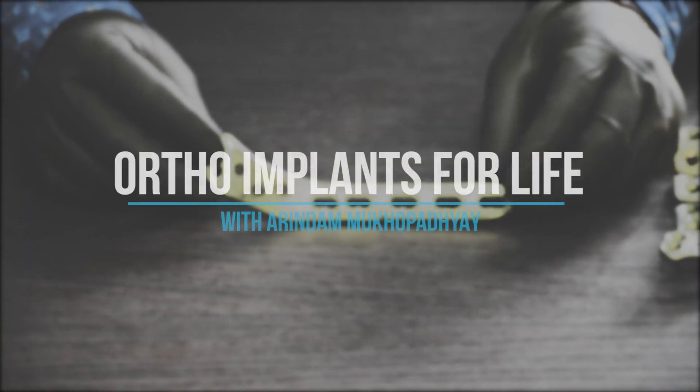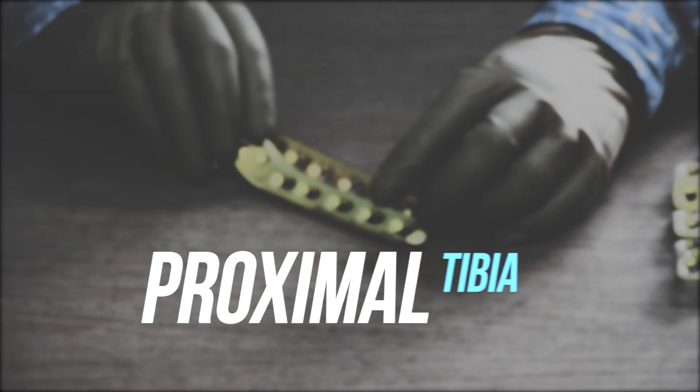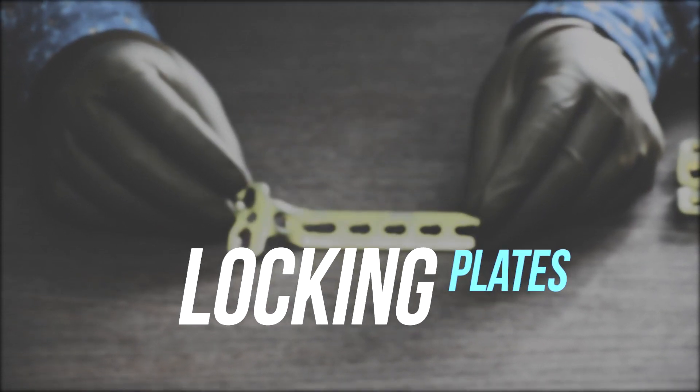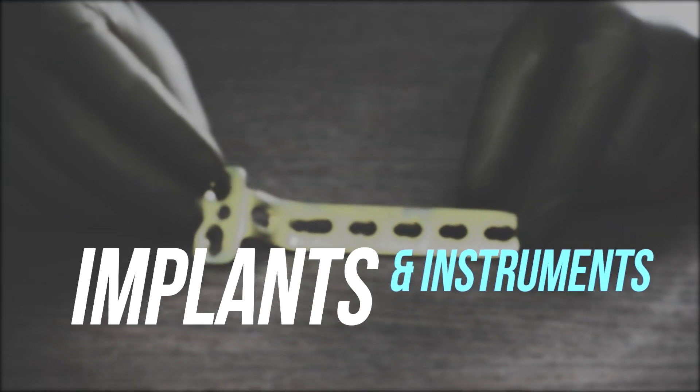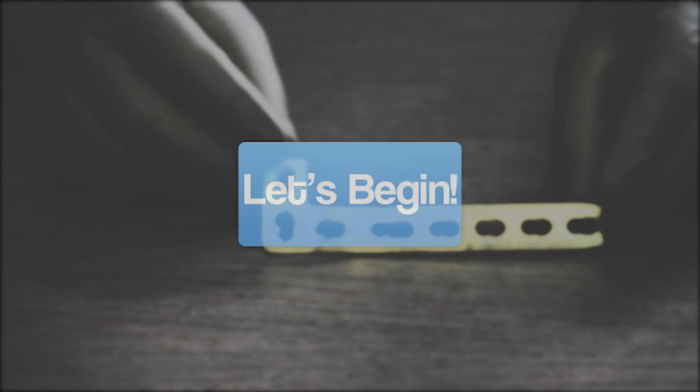Hello everyone, welcome to Ortho Implants for Life. This week we will discuss about different types of proximal tibia locking plates and other related instruments required for proximal tibia fracture fixation. So let's begin.